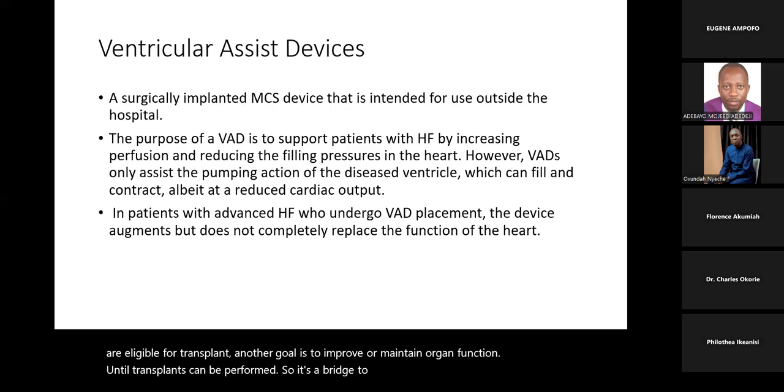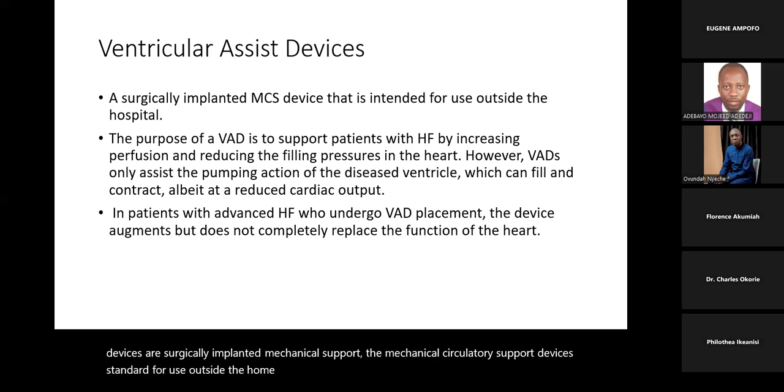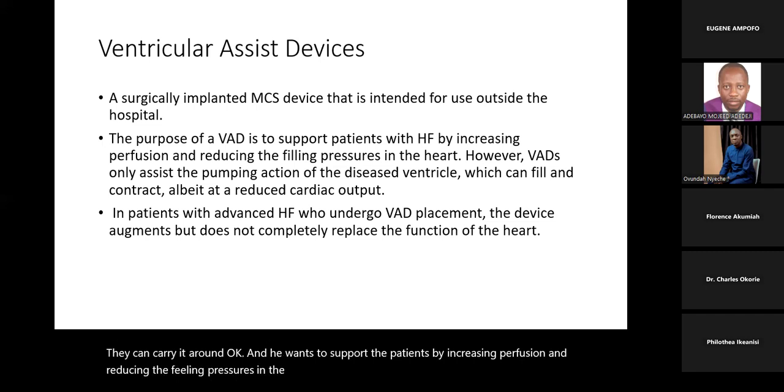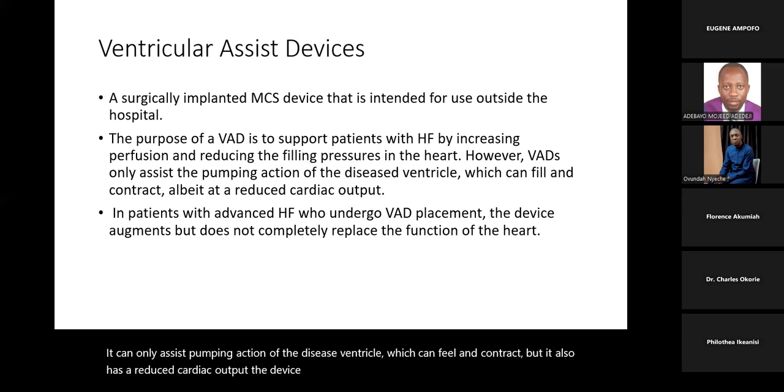Okay, so ventricular assist devices are surgically implanted mechanical circulatory support devices that are intended for use outside the hospital, so they can carry it around. They support patients by increasing perfusion and reducing the filling pressures in the heart. It only assists the pumping action of the diseased ventricle, which can still fill and contract, but does so at a reduced cardiac output. The device augments the function. It doesn't completely replace the function of the heart, but it helps to augment it.